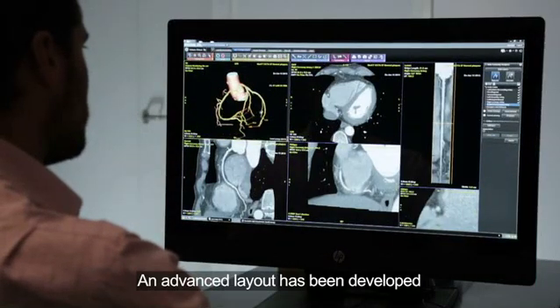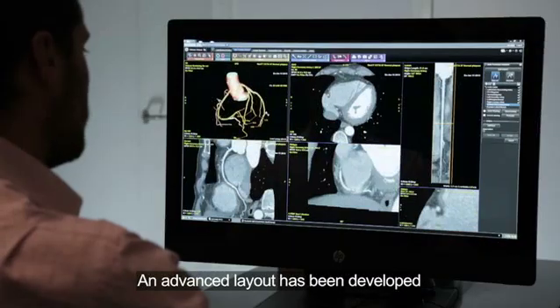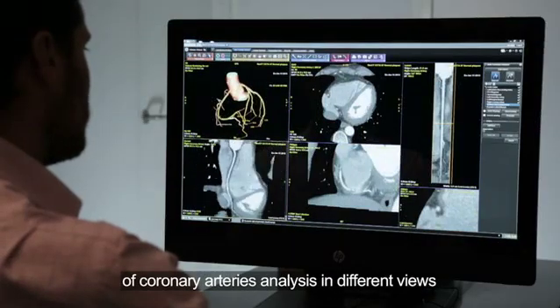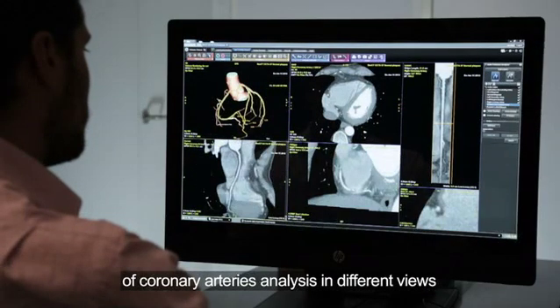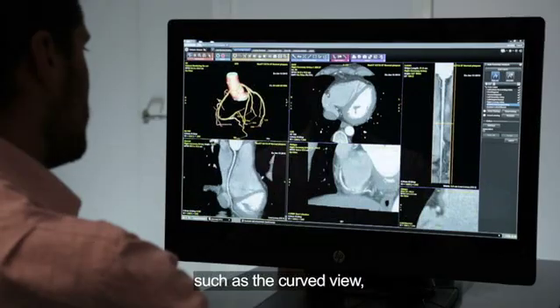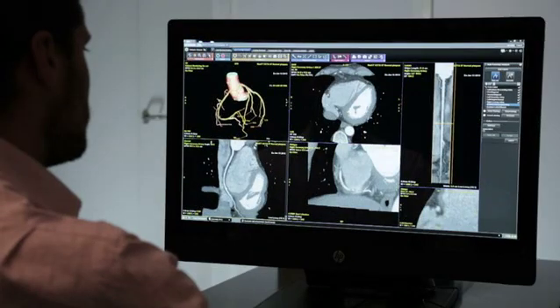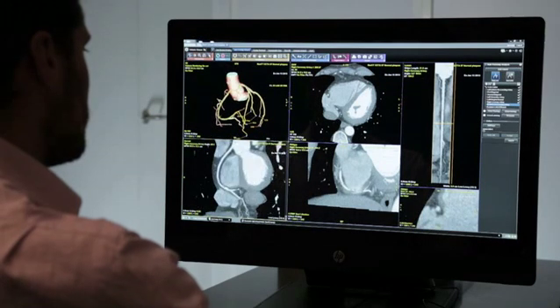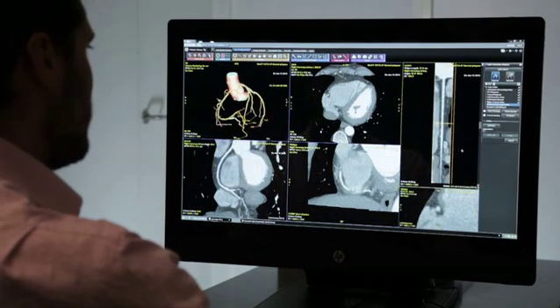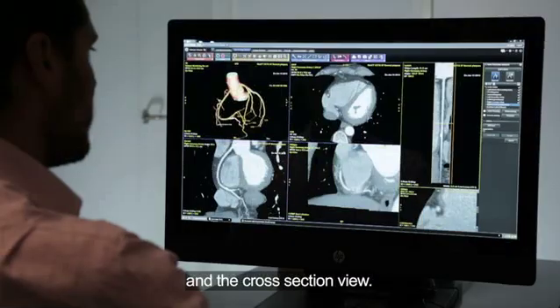An advanced layout has been developed for optimal segmentation and coronary artery analysis in different views, such as the curved view, the lumen view, and the cross-section view.